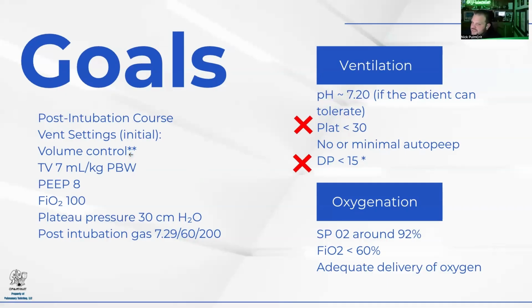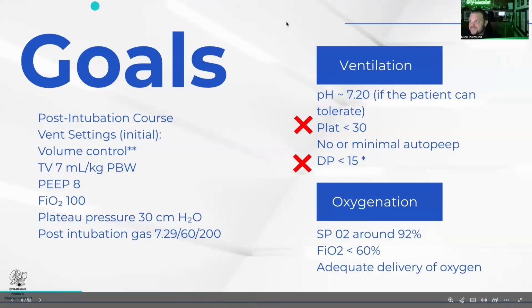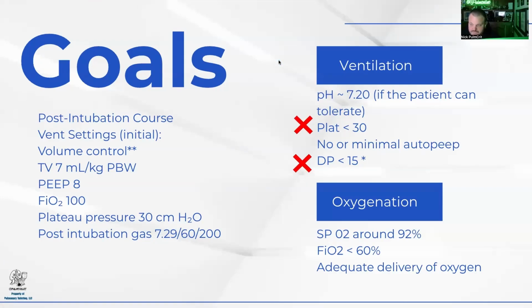Now you could say just increase the PEEP, right? We could just increase the PEEP. That's what I hear: make the driving pressure less than 15, just crank the PEEP up, especially if you went by the PEEP FiO2 table. If you saw 100% with a mediocre gas, which 160, 200 is not the worst but not amazing, and you went off the PEEP FiO2 table, you'd be on about 20 centimeters of water.